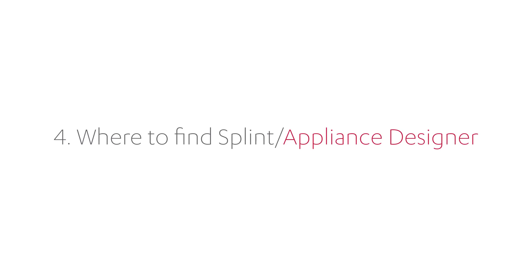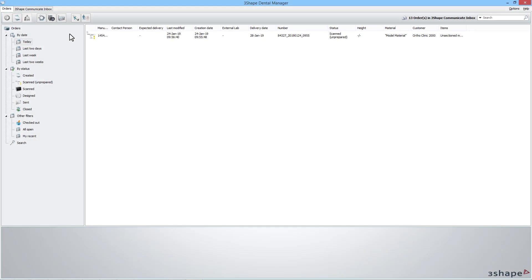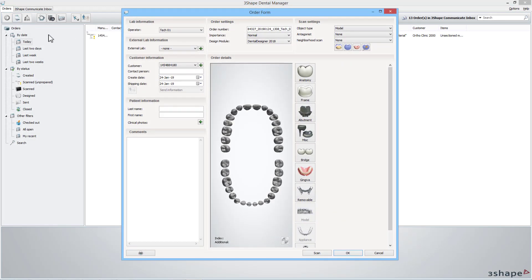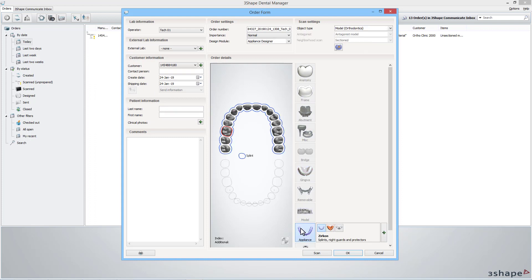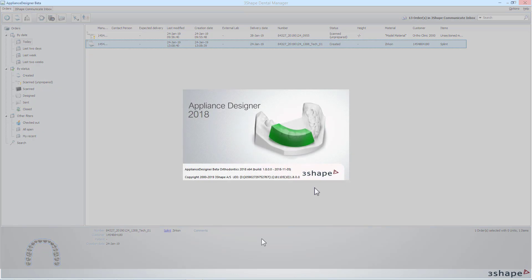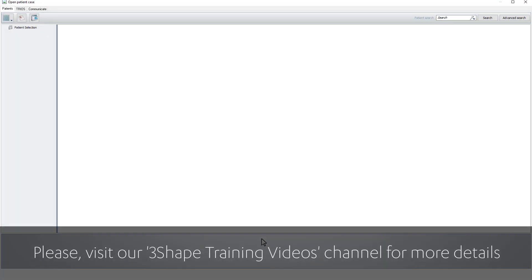Appliance Designer is still available to design splints or other orthodontic appliances. To use it, one has to create a splint case in Dental System in the normal way. This will start the Appliance Designer. To learn more about this, please see our other videos on Appliance Designer.